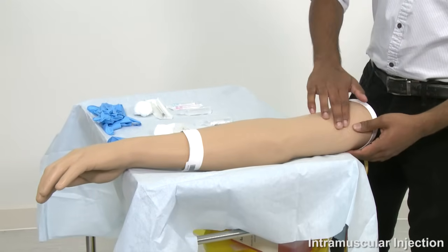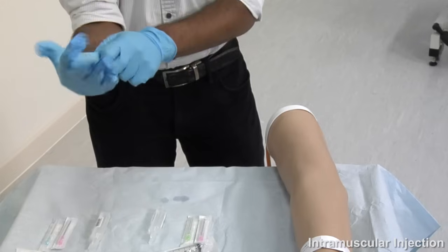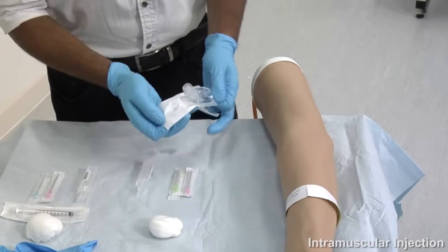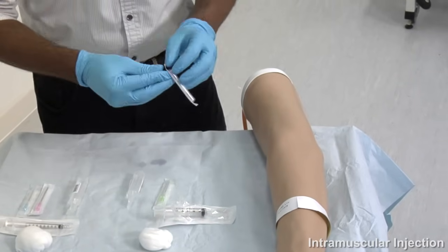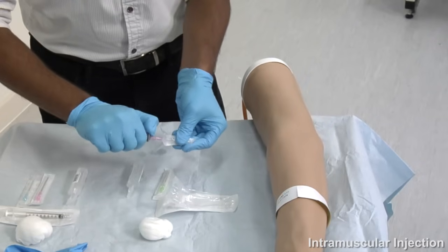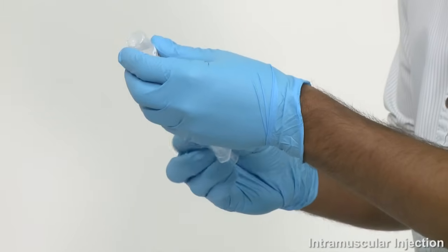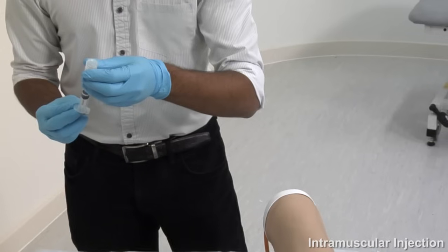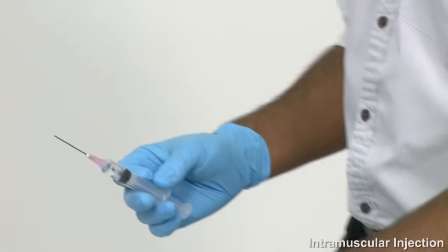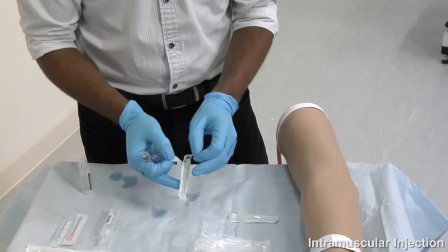You may then begin to prepare your injection by drawing up the drug using the syringe and drawing up needle. Ensure you are wearing gloves when drawing up a drug. Once this has been done, proceed to removing the drawing up needle and attaching the injection needle — usually blue or green depending on the size of the patient — being careful not to expose the needle until you are ready to inject.